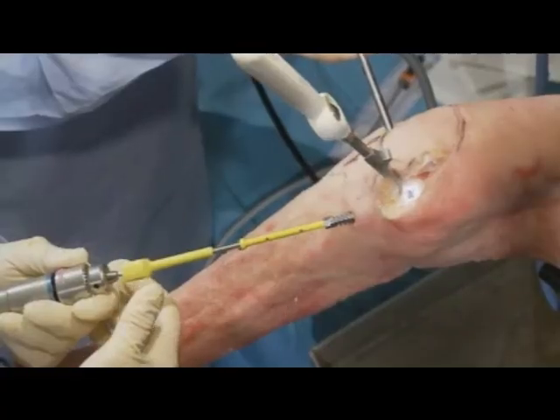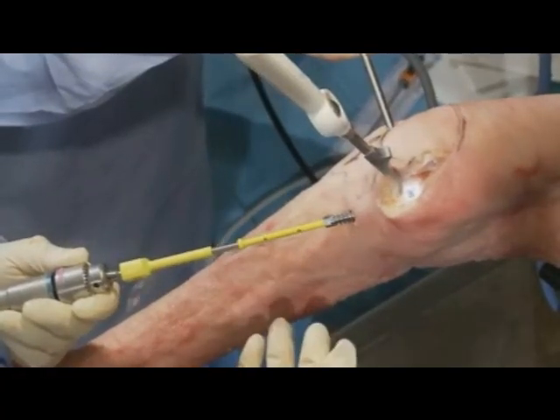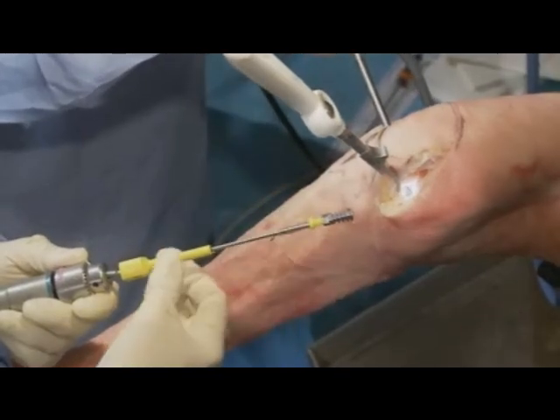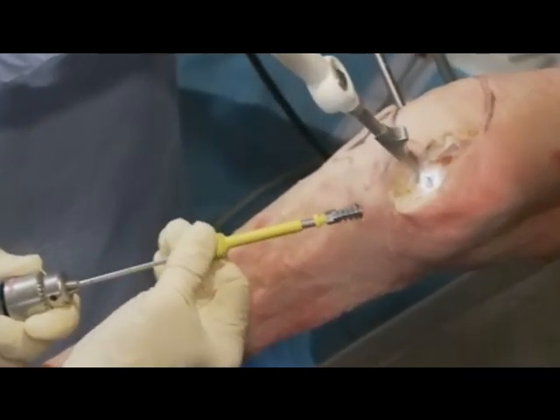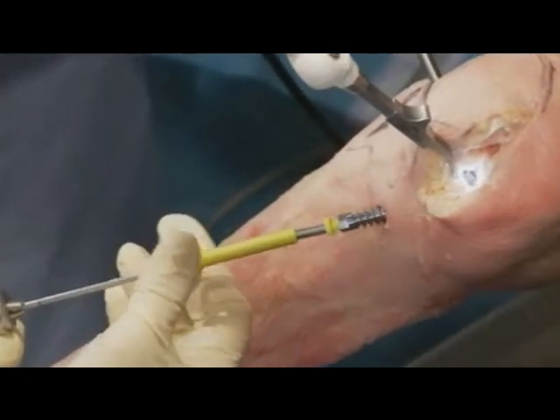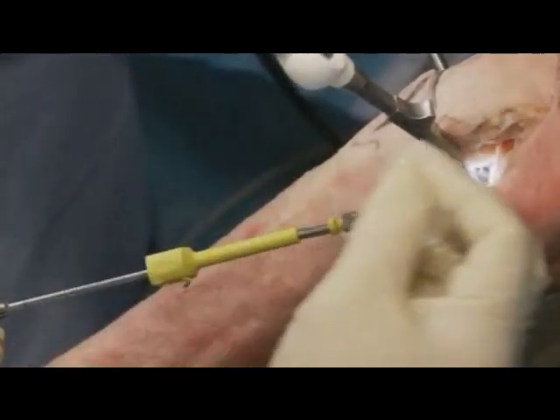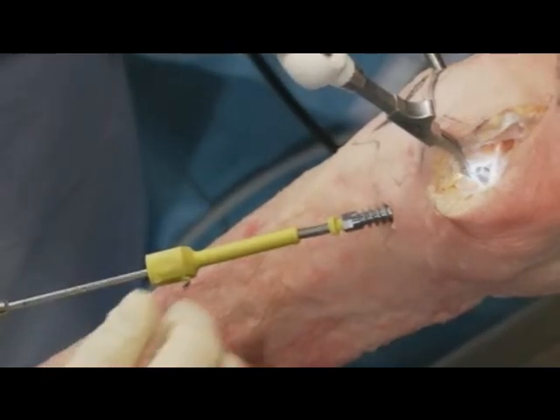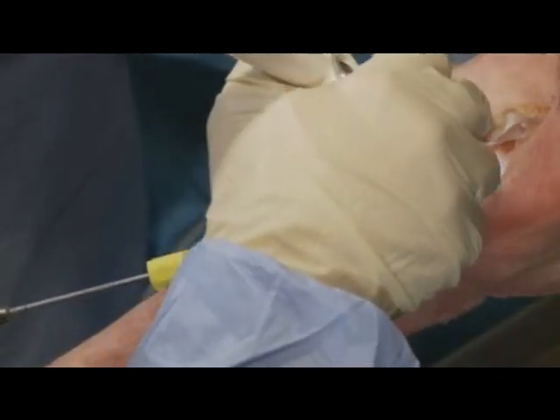Now, if you go to the outside picture again, we can show you what happens here. So now we need to lock our blade into position, so we have a locking mechanism that slides up through the screw, and we have a device here that catches it and locks it, so that now when we drill, we can cut backwards and the whole device is locked. And you can see it's calibrated off of a spring mechanism. So go back to the scope portion.